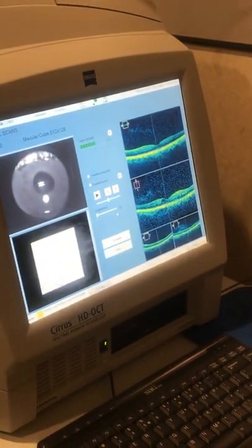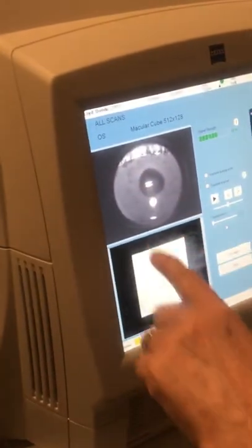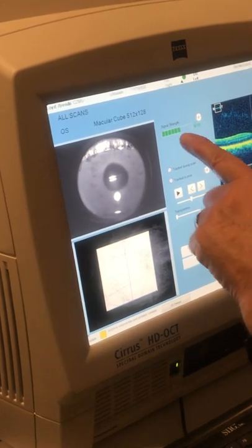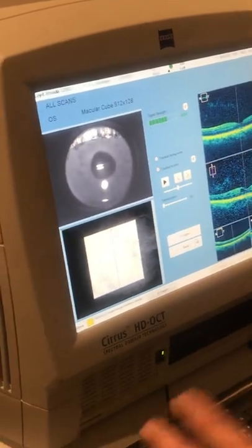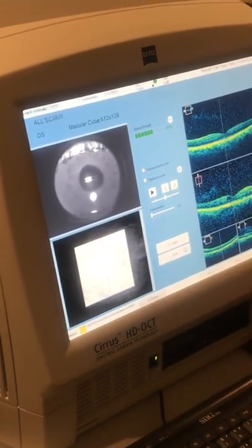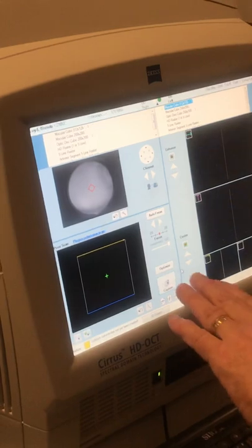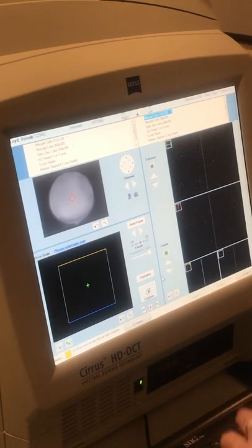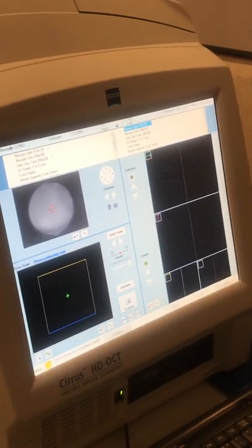Now, we've got a couple of things going here. You have small pupils, and this pupil's a little irregular — see the shape of it? We've got some vignetting we might not have got if you were dilated. We've got 6 out of 10. If this went down to 5 out of 10, those bars would go red and say that's not really the best we could do. Six out of 10 is okay — we'd like to get better, but chances are we're not going to. You can tell it's easy and quick to get the scans, but in this case we're just going to stop and say that's good enough. We have finished scanning.